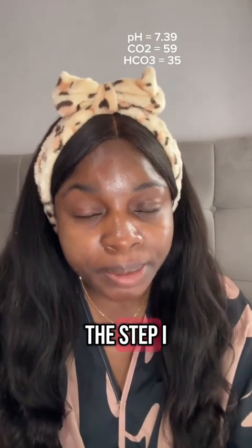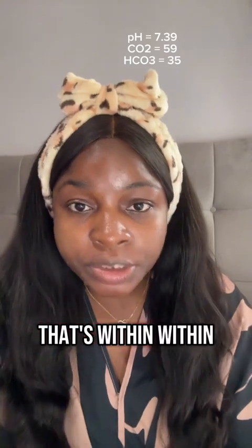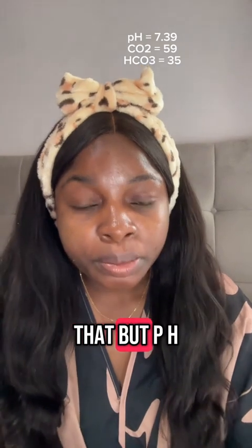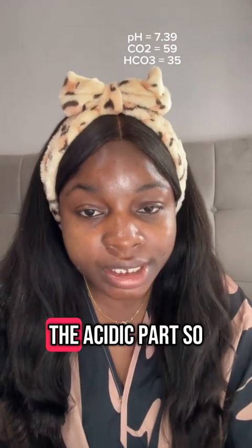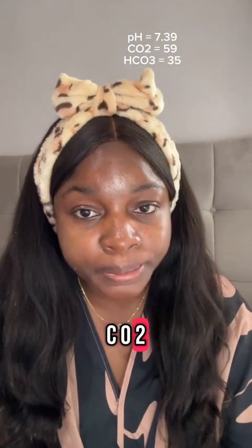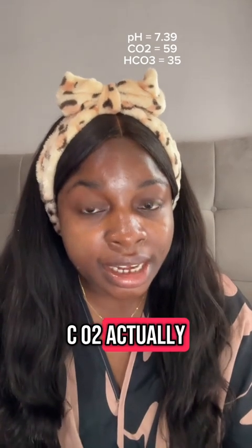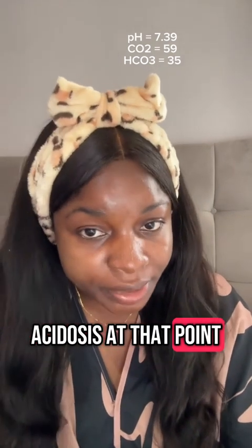Let's follow the steps I showed earlier. First thing is look at the pH. What is the pH? 7.39. That's within the normal range, so the pH is normal. But a pH of less than 7.40 is towards the acidic side, though it's within the normal range. Let's move on to the next step and check the CO2. The CO2 is 59. That is high. A high level of CO2 shows the presence of acid, so it's respiratory acidosis at that point.